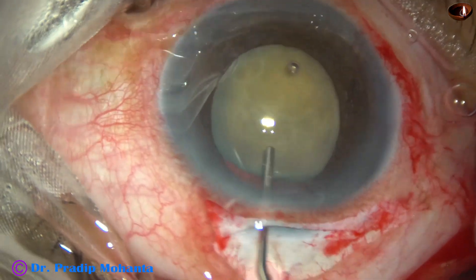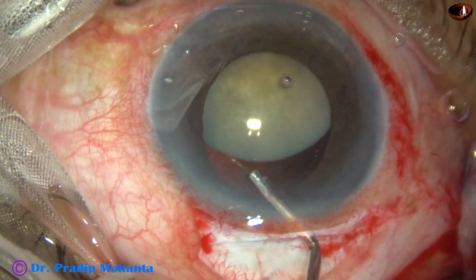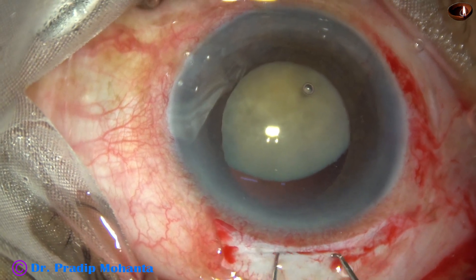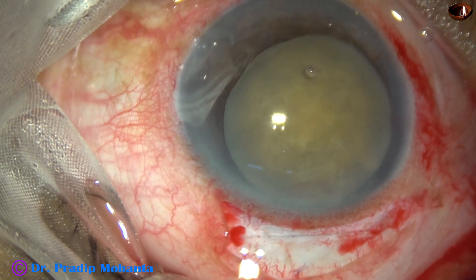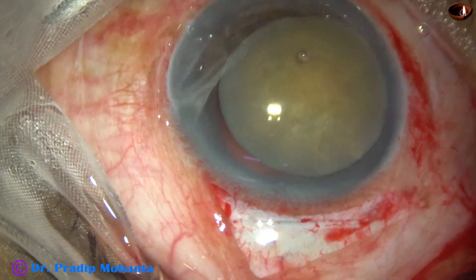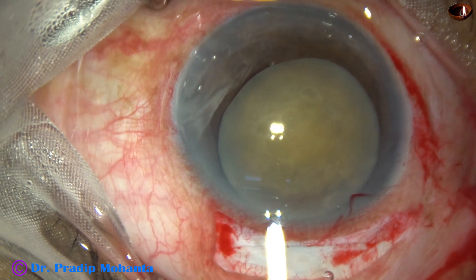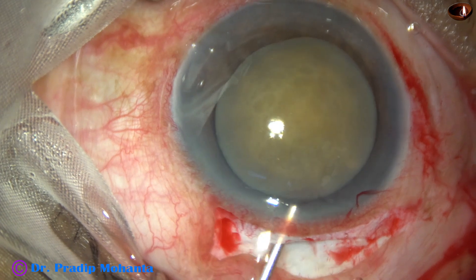At this time I take help of two hooks. I inject some viscoelastic behind the nucleus to protect the posterior capsule, and bring it out of the capsular bag, then inject some more visco. The wound size appears a little less than the size of the nucleus, so visco expression may not be possible.